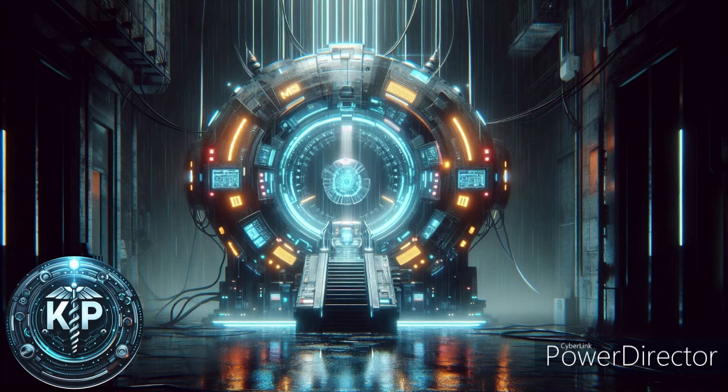Faraday cage. The entire MRI scanning room acts as a Faraday cage, which is an enclosure used to block external static and non-static electric fields. It's an essential part of the RF shielding of the MRI suite.